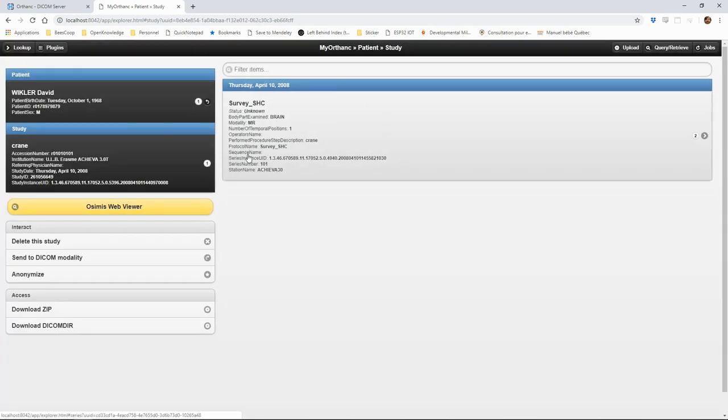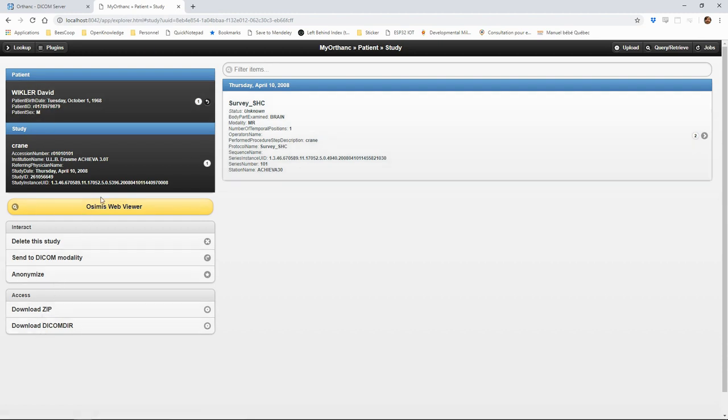In the study page, we have the list of series. We also have a link to a web viewer called OzyMIS which provides an interface for viewing the images.